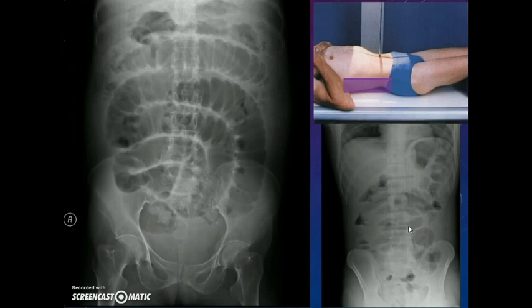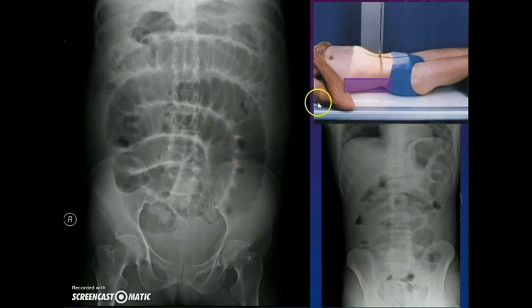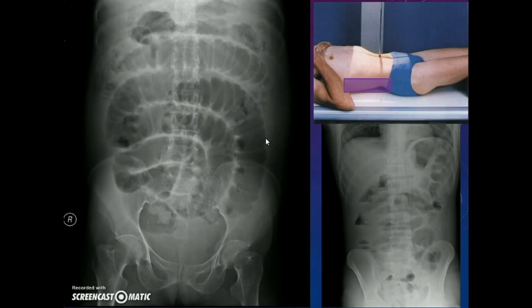In the supine view, the fluid in the bowel floats down and the air in the bowel floats up. So you will see a better delineation of the bowel. To understand the involved bowel better and to understand which bowel loop is dilated, the supine view is much better than the erect view. For the diagnosis of intestinal obstruction the erect view is better, but to understand which bowel is involved the supine view is better. It will give us an idea of the level of obstruction.